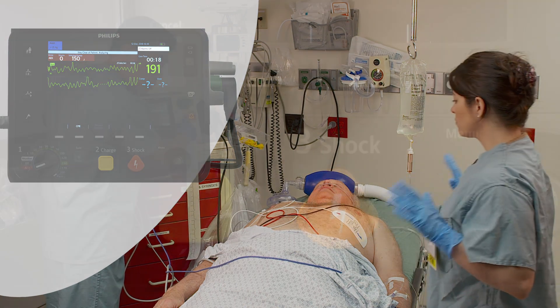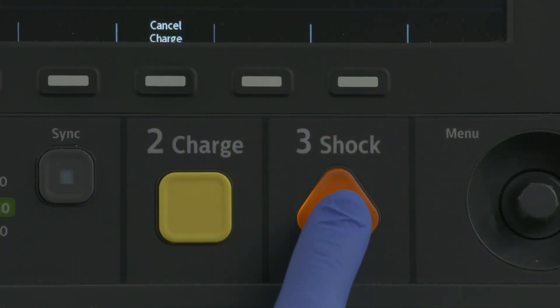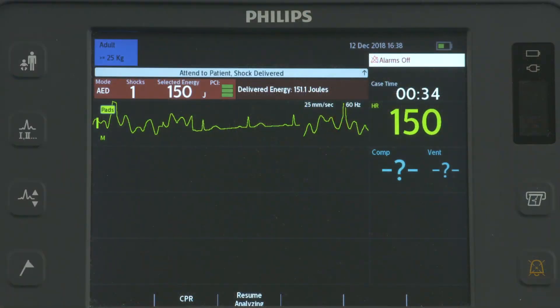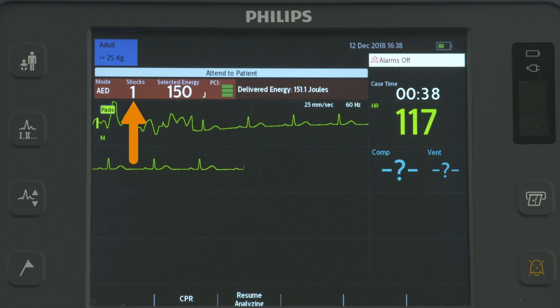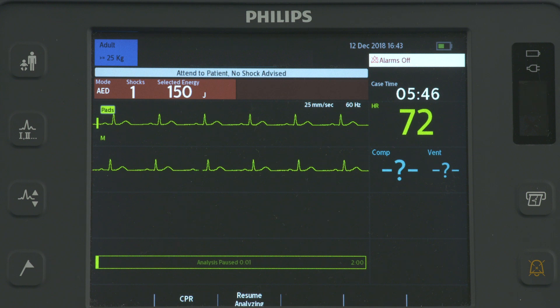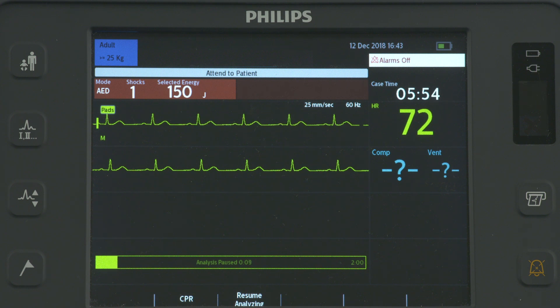Call out clearly and loudly, "Stay Clear," then press the flashing orange shock button to deliver a shock. Upon delivery, "Shock Delivered" is announced and the shock counter registers the number of shocks delivered. After a shock is delivered, the device pauses and you are prompted to begin CPR.